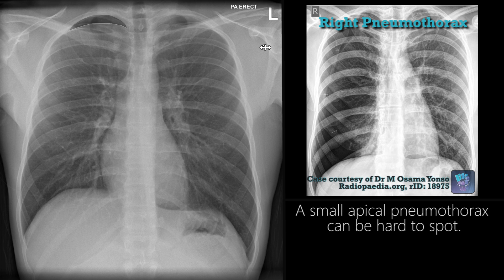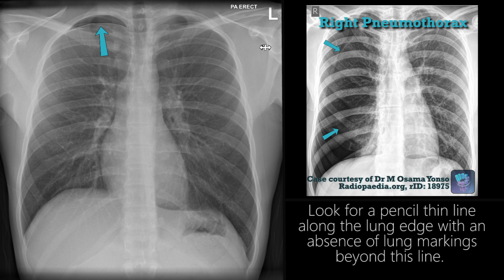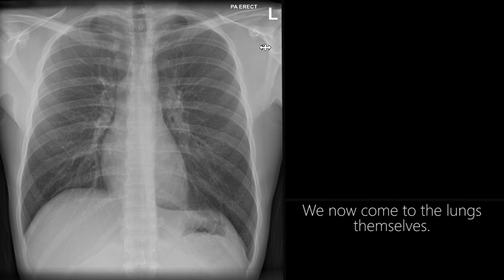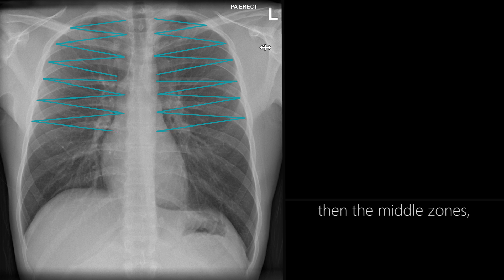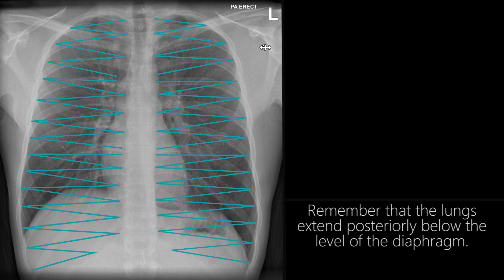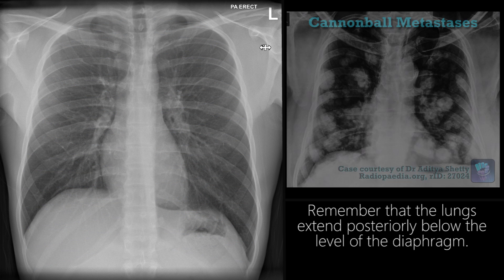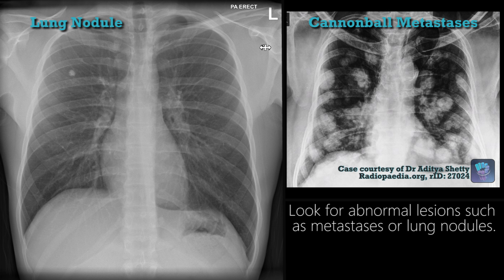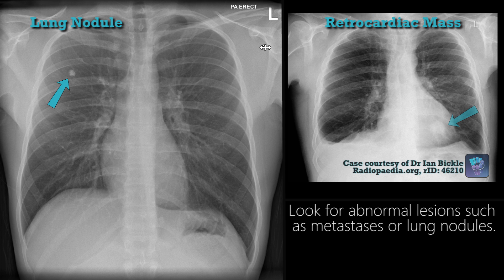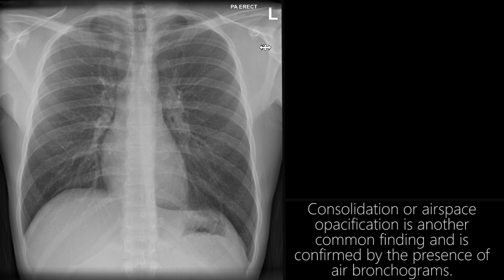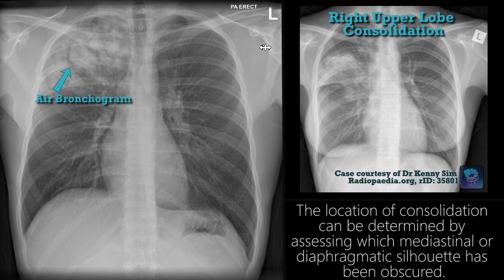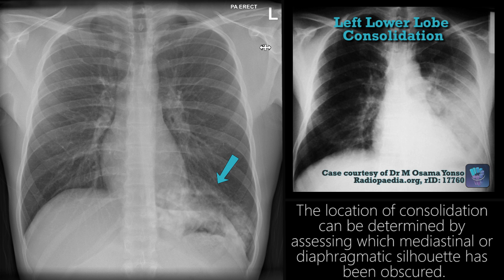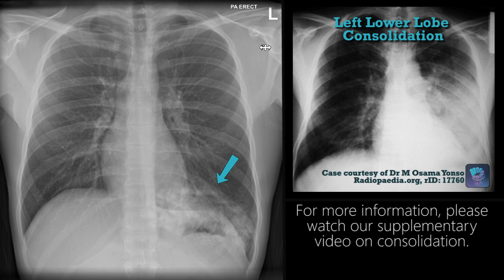A small apical pneumothorax can be hard to spot. Look for a pencil-thin line along the lung edge, with an absence of lung markings beyond this line. We now come to the lungs themselves. It is crucial to compare the bronchovascular markings on one side to the other. Compare the upper zones, then the middle zones, and then the lower zones. Remember that the lungs extend posteriorly below the level of the diaphragm. Look for abnormal lesions such as metastases or lung nodules. Consolidation or airspace opacification is another common finding, confirmed by the presence of air bronchograms. The location of consolidation can be determined by assessing which mediastinal or diaphragmatic silhouette has been obscured. For more information, please watch our supplementary video on consolidation.